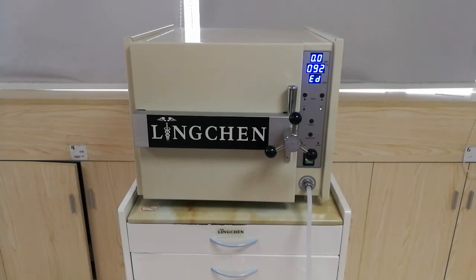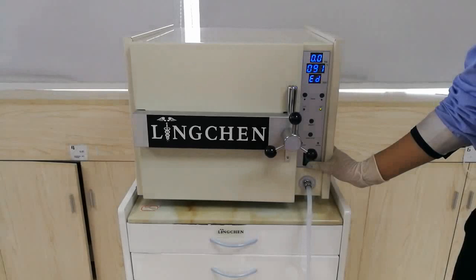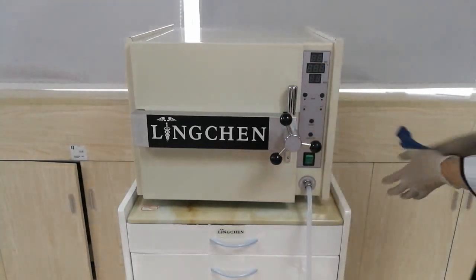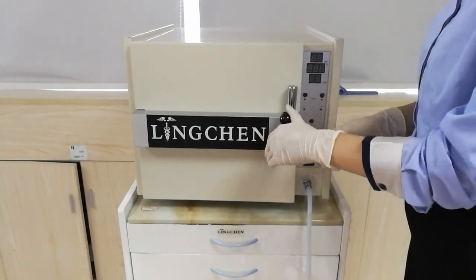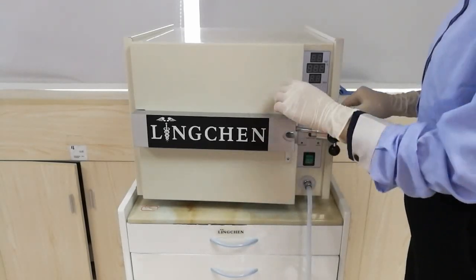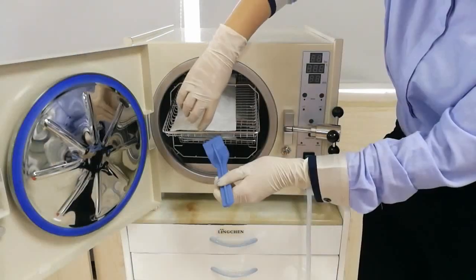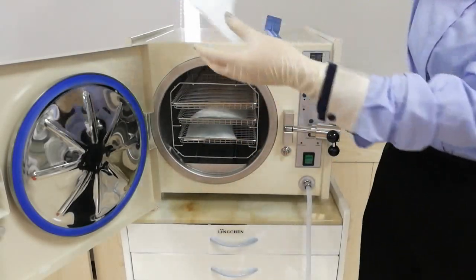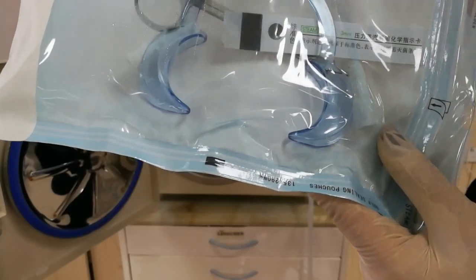Now it's done. We turn off and open the door. You can see the paper is dry and the color has already changed to black.